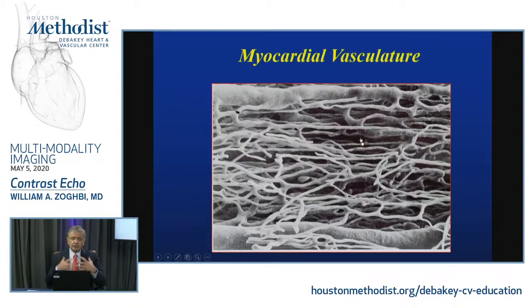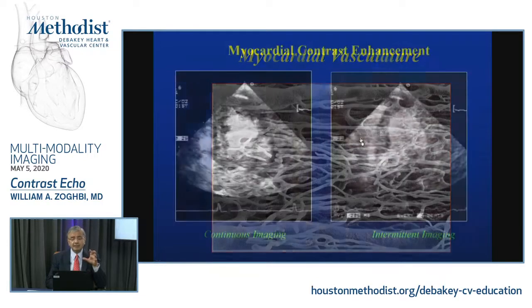So we talked about opacifying the ventricle, et cetera, and enhancing the Doppler signals. But now if you're looking at flow in the myocardial vasculature, you're looking at flow within these tiny capillaries as well as the venules. It's not going to differentiate capillaries from venules because this is whole myocardium, right? So contrast is passing by, it's very tiny microbubbles, so it's not obstructing in that area. And we talked about that how much you're going to see depends on how much energy you send through this transducer.